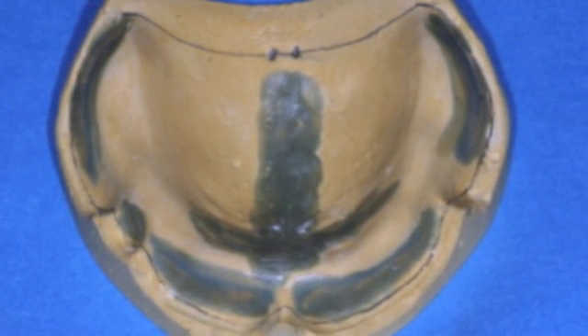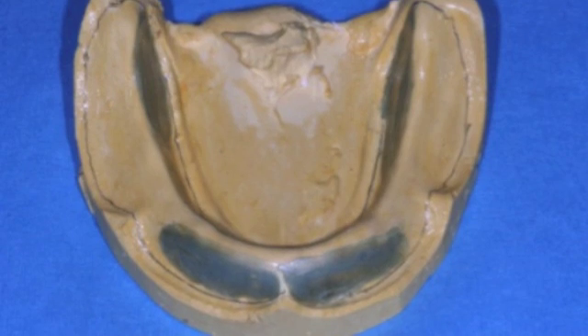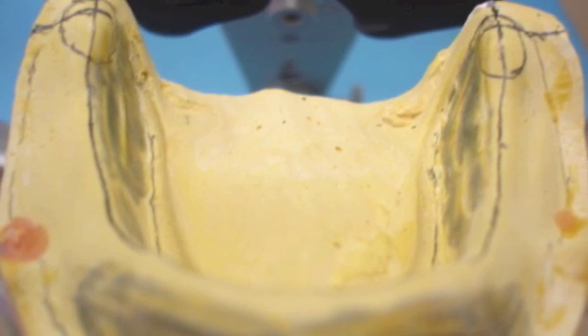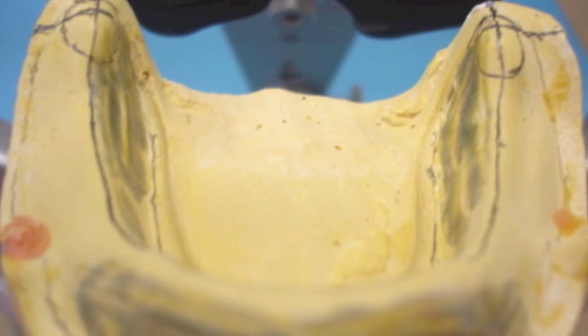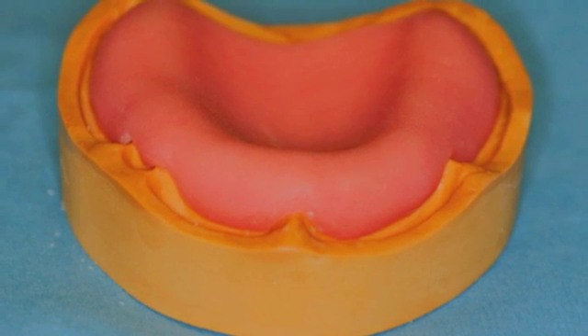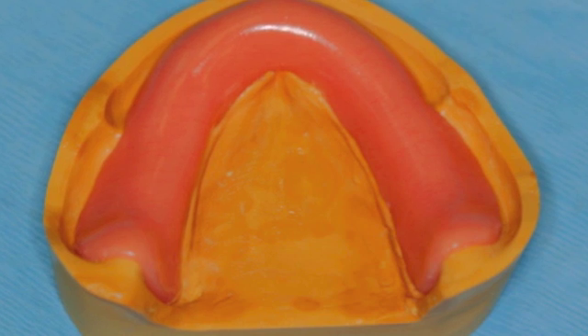First, use blue wax to block out the undercuts on the maxillary and mandibular casts. On the mandibular cast, mark the crest of the ridge and a horizontal line two-thirds up the retromolar pad. Next, adapt, cure, and edge polish the pink fiber triad record base on the maxillary and mandibular model as shown.